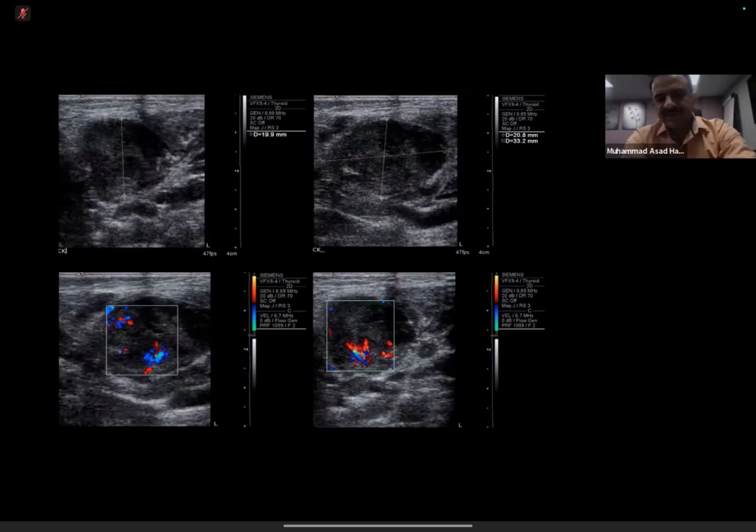You described it very well. The only thing which I would like to add is that once you have identified that this is the lymph node, the next thing ideally you should comment whether it is still retaining its hilum or not. Because as you know, reactive lymph nodes tend to retain their hilum, and all those lymph nodes which are involved in metastatic process or slightly malignant process, they tend to lose their hilum fairly early.